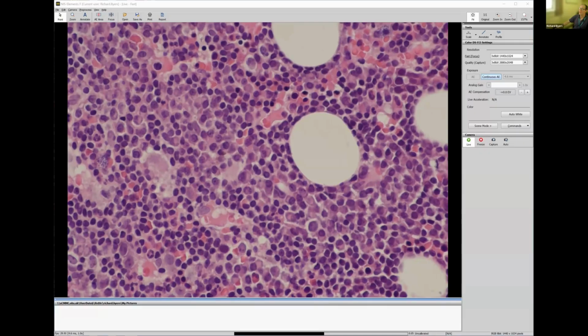So the flow cytometry again showed a 58% lymphoid population, but no excessive plasma cells. And there wasn't any clonality demonstrable on the flow cytometry, but that's not uncommon. So there's definitely lots of plasma cells, and the clinical question was query myeloma. So we did plasma cell markers.